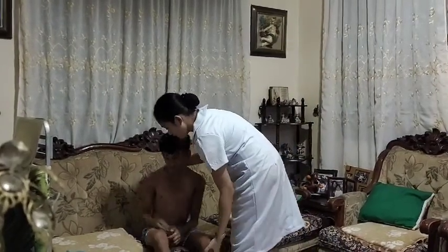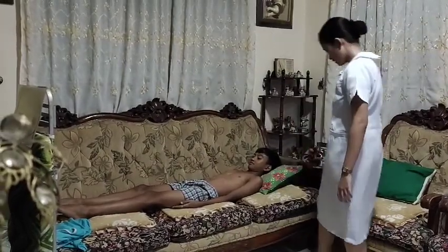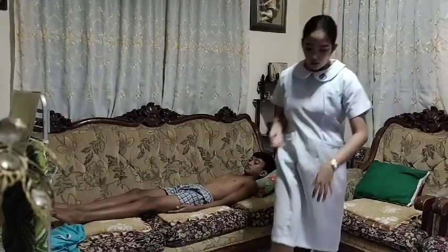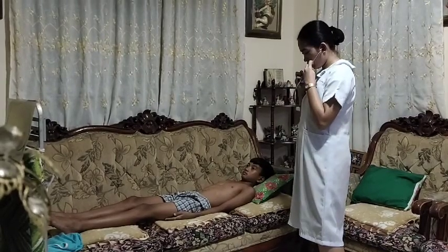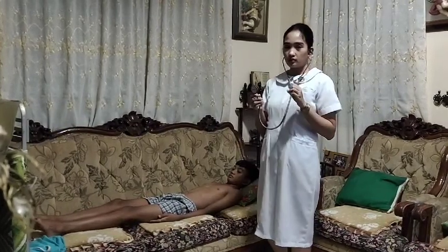Next, we need to keep the patient in supine position with the head elevated 30 to 40 degrees. We can use a pillow to elevate the head of the patient, 30 to 40, like this. Next, we need to warm up our stethoscope so that the patient will not be shocked by the cold temperature of the stethoscope. We just need to use the bell of the stethoscope to listen to the 4 heart anatomical areas.